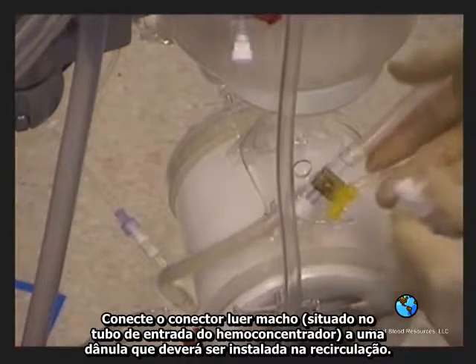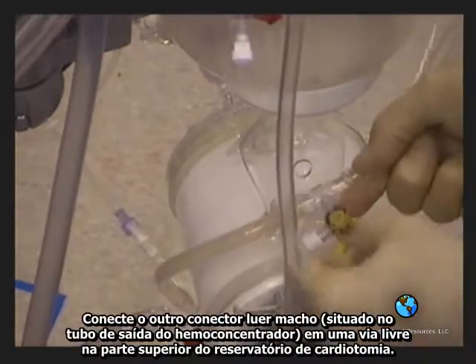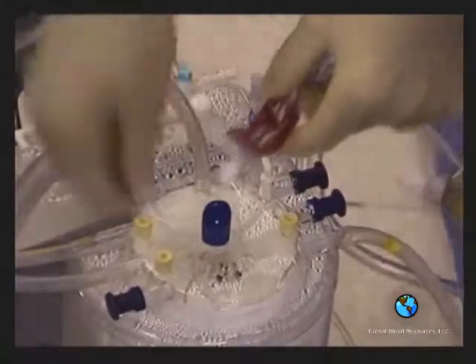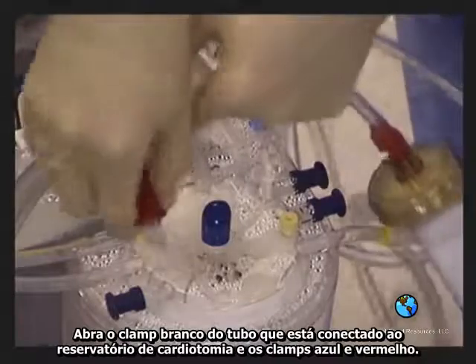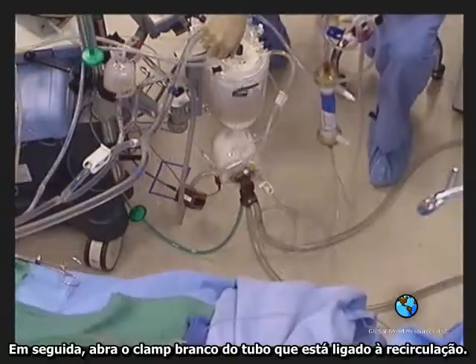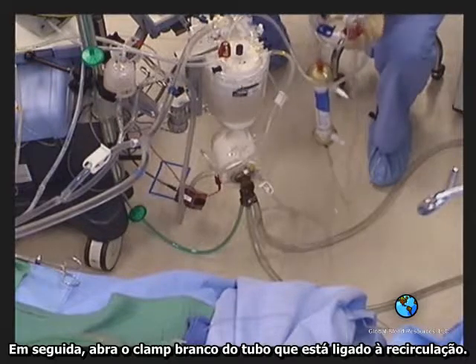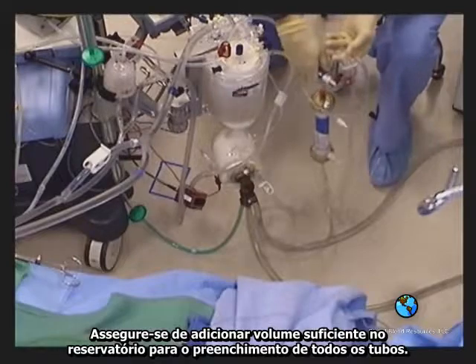Connect the white pinch clamp swivel luer to a high pressure source connection, like your recirc line with a 3-way stopcock. Connect the red pinch clamp's return line to the venous reservoir or cardiotomy using the swivel luered end. Open up the 4 pinch clamps starting at the reservoir. The last one is the white pinch clamp connected to the high pressure source.